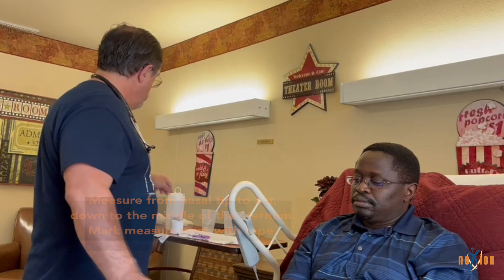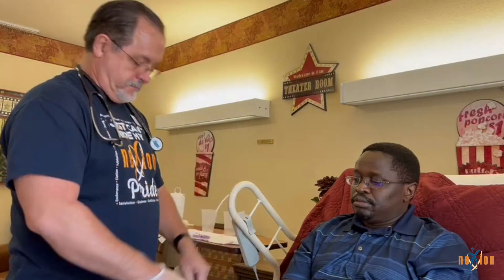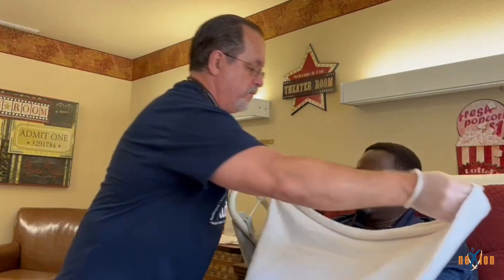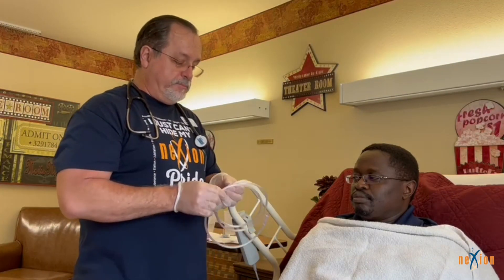From there, put on clean gloves. As you put on the gloves, take a towel and place it across the resident's chest. After you have the resident sitting up, the towel in place, and the NG tube already measured, you're ready to proceed.